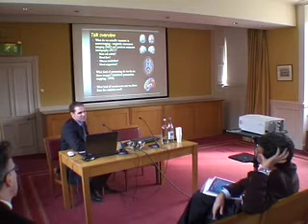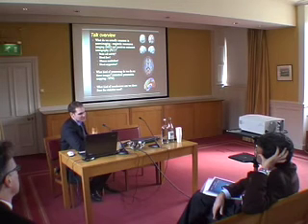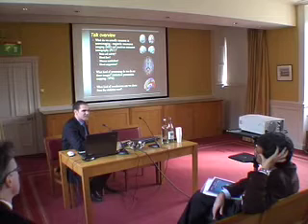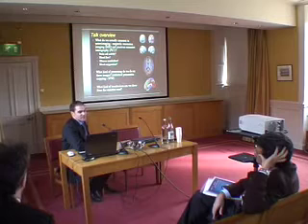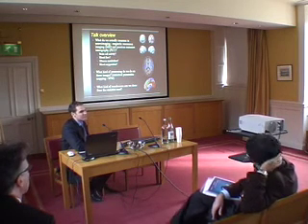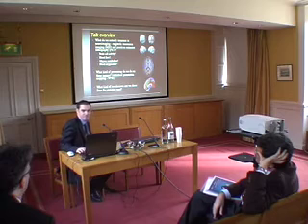And there are actually lots of different things that we can measure depending on the particular technology. So we could measure blood flow, for example, because different parts of the brain, when they are responding, use up energy, and that needs to be replenished, so we need to deliver glucose and oxygen to the parts of the brain that are working hard. So we can measure blood flow itself, or glucose metabolism, or we can measure blood oxygenation. And in most brain imaging studies, what you're probably going to be looking at measurements of is blood oxygenation, as we will see by a rather circuitous route.